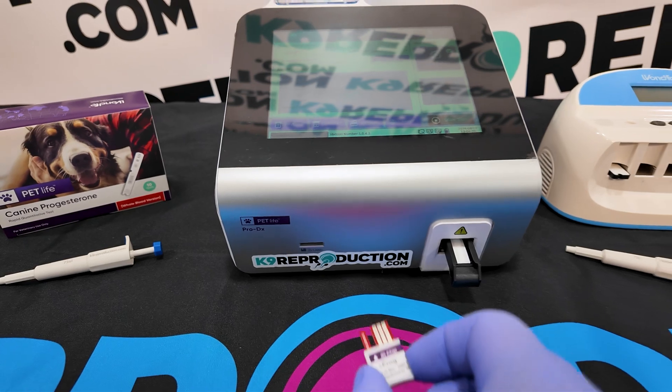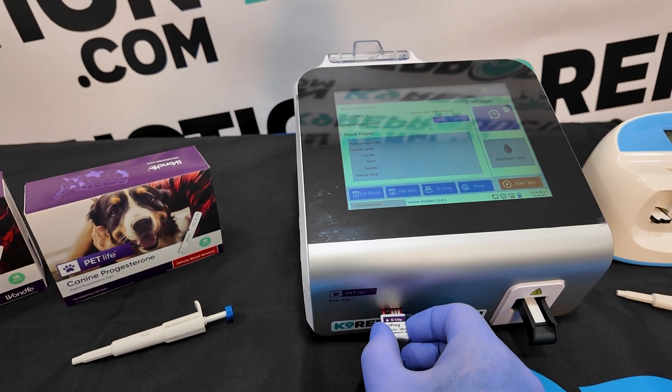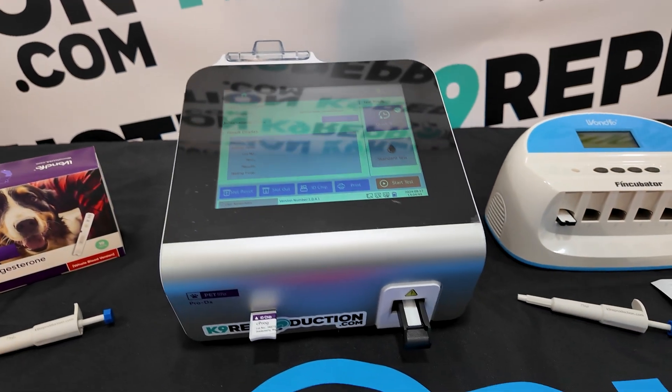Before proceeding, make sure to insert the ID chip into the machine. Each new box of tests comes with a fresh ID chip. Discard old ID chips after use.